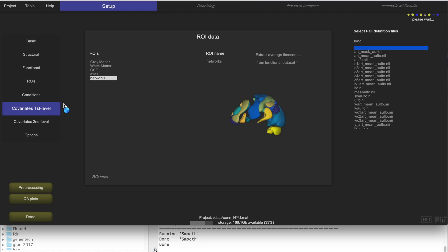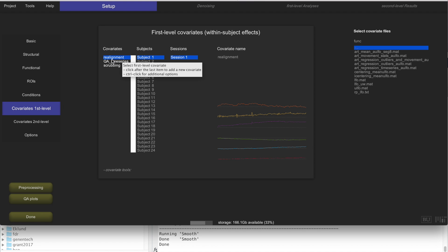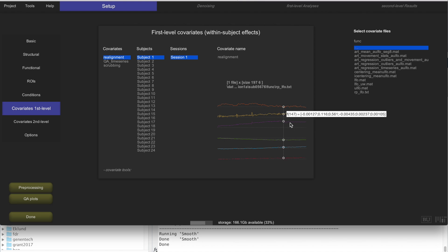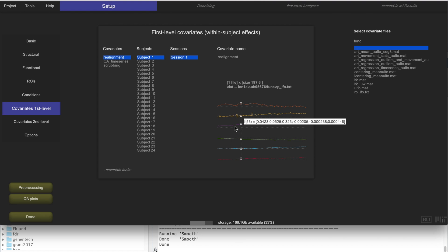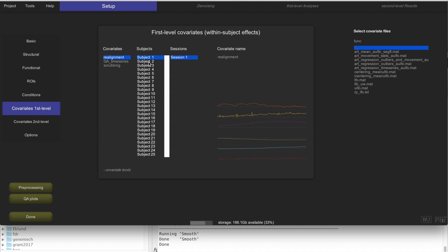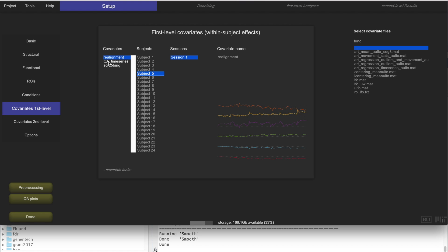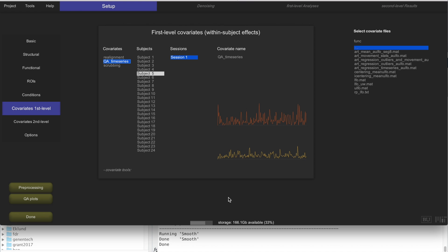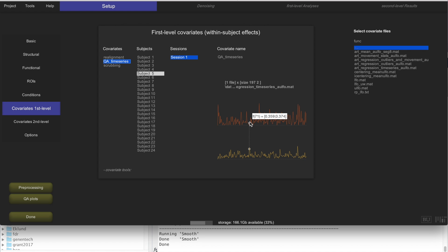Another thing added to your project automatically by preprocessing are first-level covariates. The first one is called realignment, which contains the actual subject movement parameters estimated across time. This is a time series representing how the subject moved within the scanner, different for each subject, estimated by realignment. Then you have quality assurance time series representing two things: how the global signal in the brain changes from one scan to the next, as a measure to identify potential outliers.